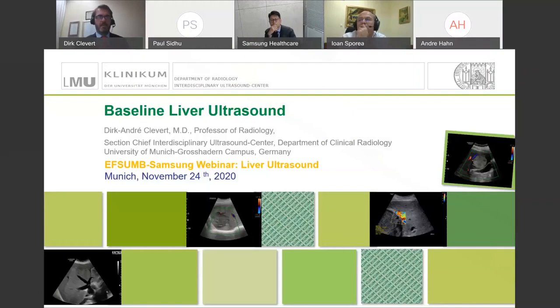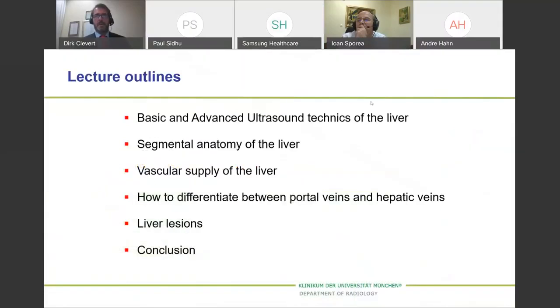Hi. So it's a great honor to speak about the baseline liver ultrasound. And when we talk about this topic, we have to think about what the agenda is.